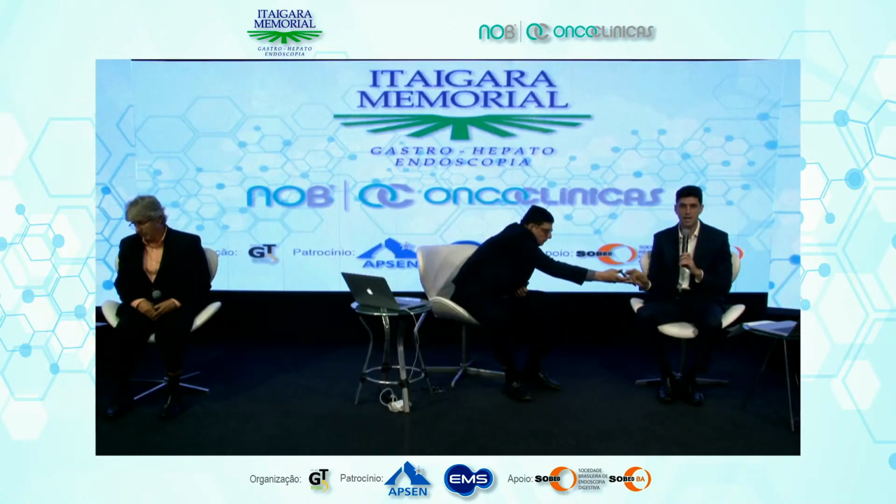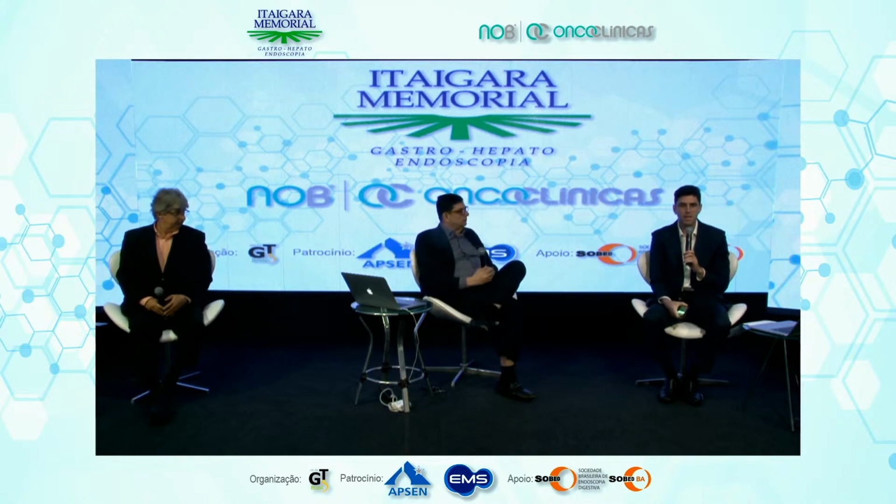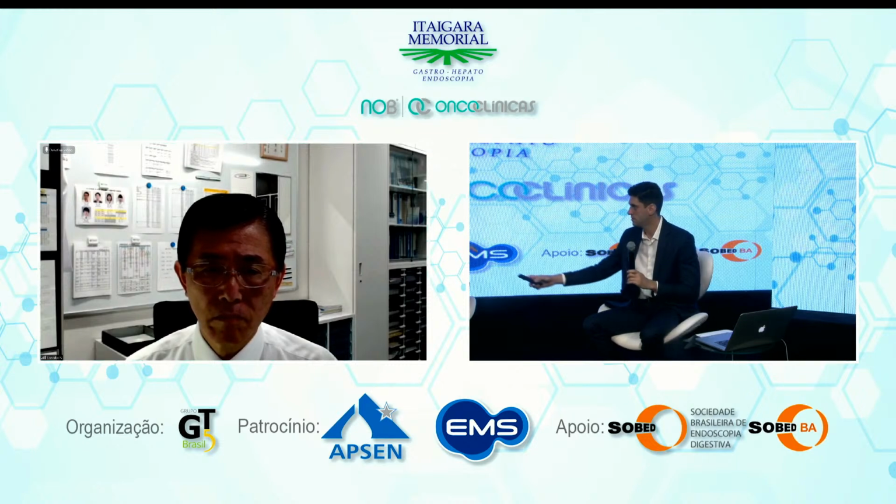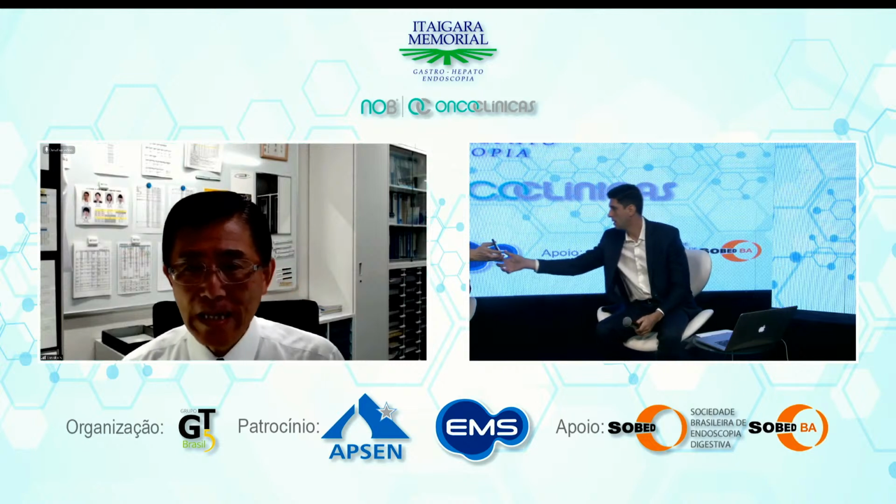ready. One of the questions that we have received concerns the gain of electronic chromoscopy and magnification in the analysis of these images. Is it mandatory to have chromoscopy and magnification to be able to use the JNET classification? Is it mandatory to have magnification to use the JNET classification? Is that okay?